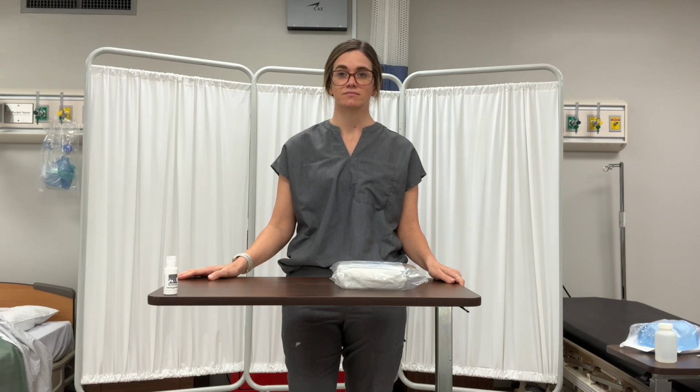We're going to talk about some principles of surgical asepsis. We always want to make sure that all items used within a sterile field must be sterile.